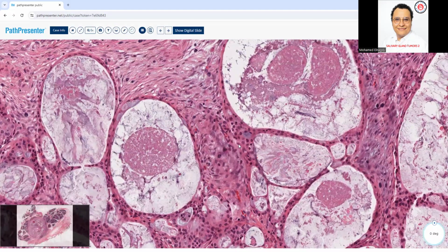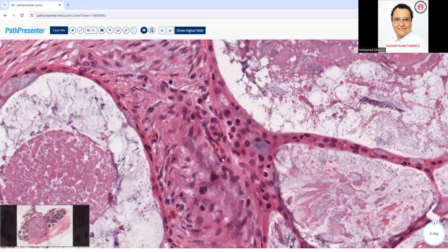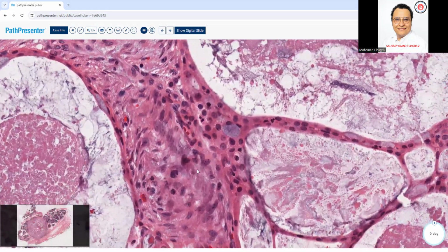So you start looking again and look for some other keywords. Is this the ex pleomorphic adenoma? We didn't even agree that there is a pleomorphic adenoma component here. Okay. But I will make it a little bit easier for you.